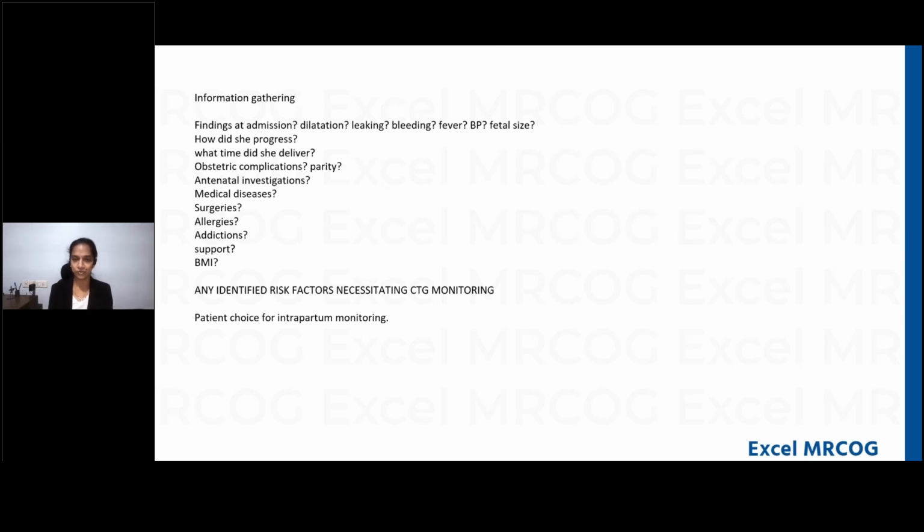But one important thing that you need to understand here is what exactly about CTG she wants to know. What are the components that are being assessed in the station? Because you can talk on CTG even for an hour, and you have only 10 minutes in the station. So you need to know what exactly you need to touch upon, what aspects of CTG monitoring you need to discuss.